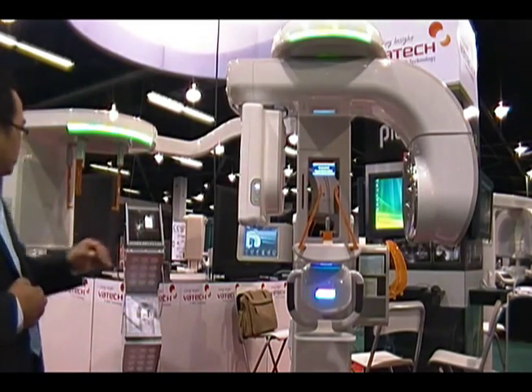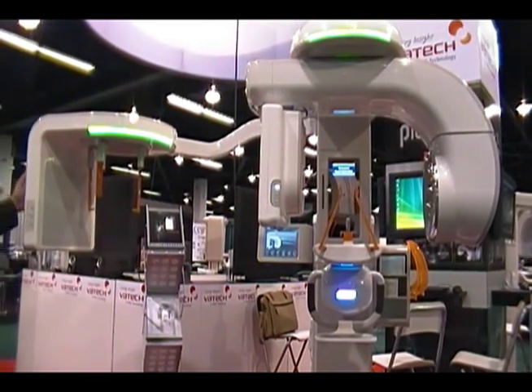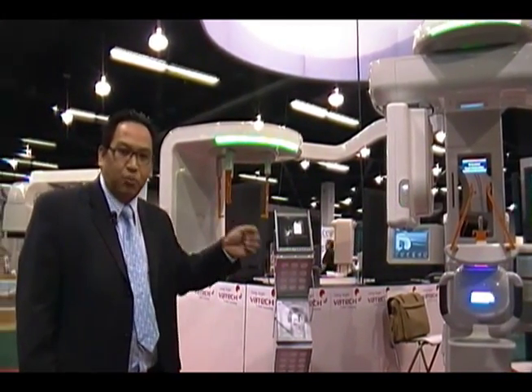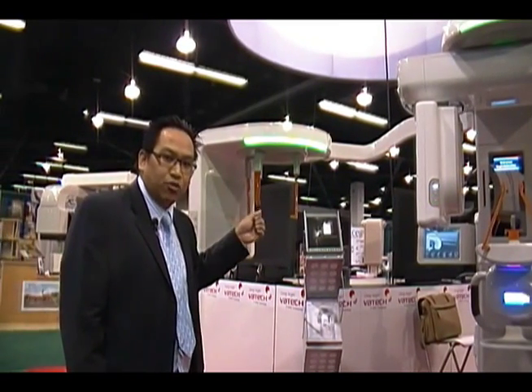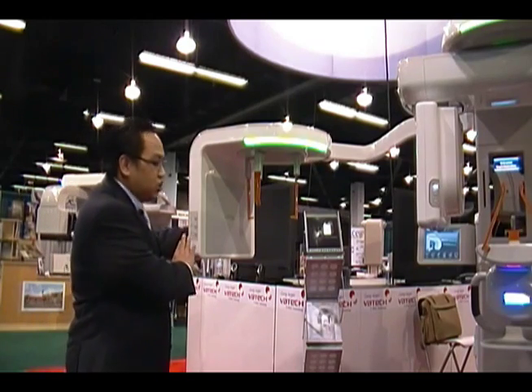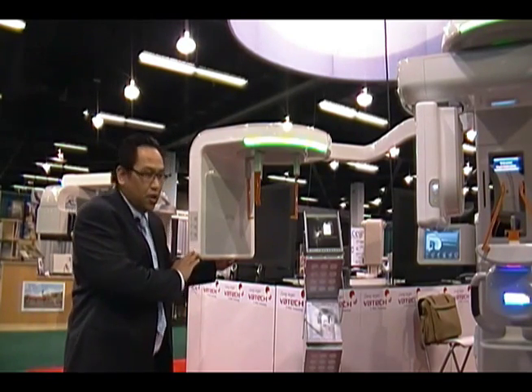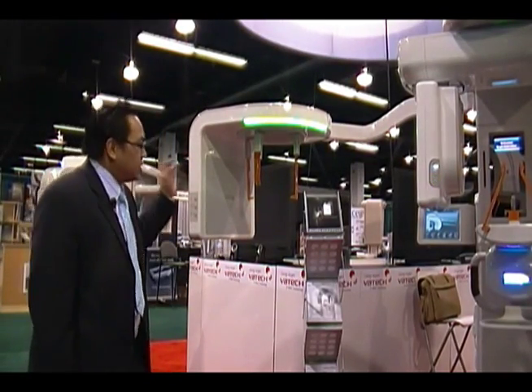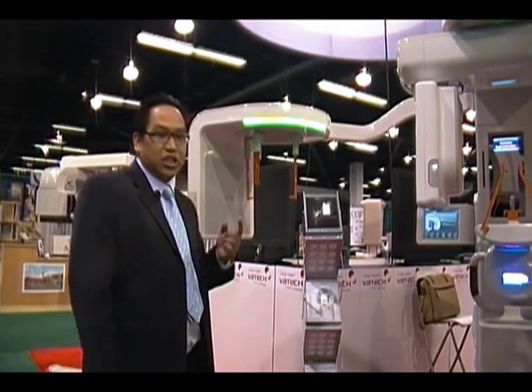In regards to our digital ceph, what we've done that's unique is instead of the traditional digital ceph, where you take your digital pan sensor and bring it over to the ceph side and scan — which takes about 13 seconds — we've replaced that with a very large flat panel sensor, as you can see here. Because of this, we're able to take an image like film. Your ceph image is now taken within less than a second — a 0.3 second pulse or a 0.9 second pulse — so you have less chance for patient motion.